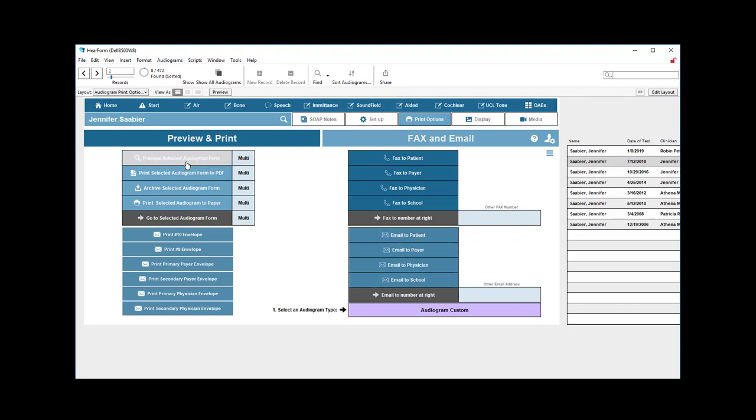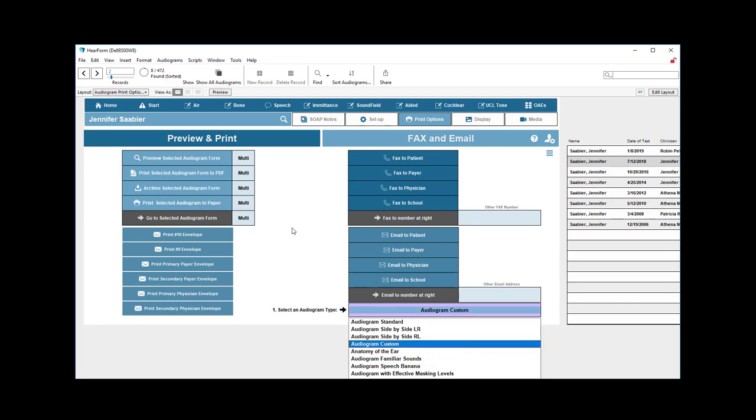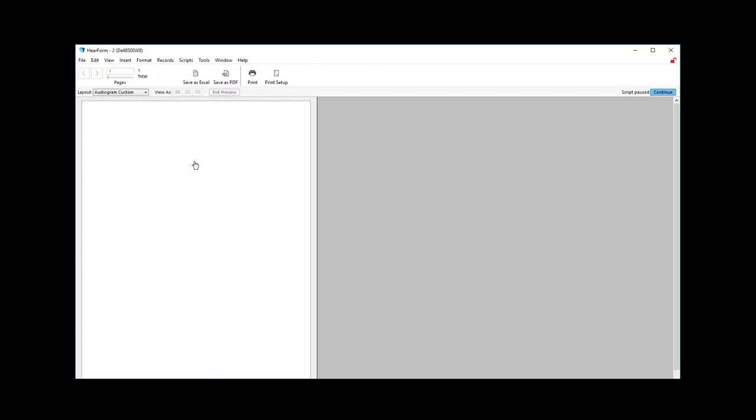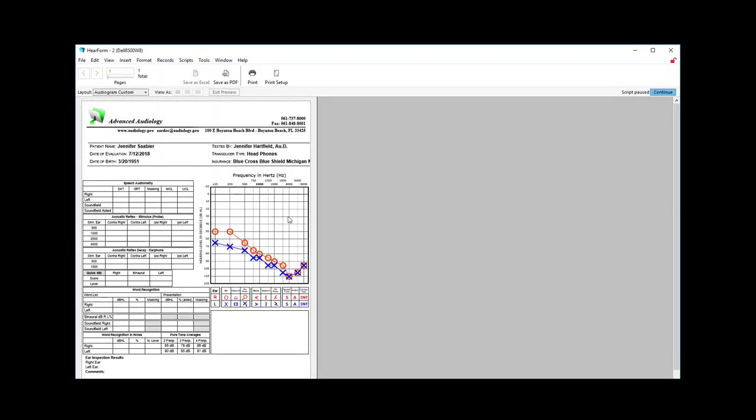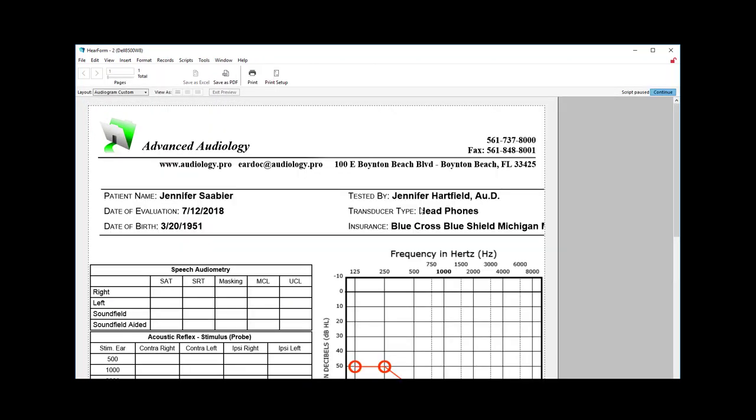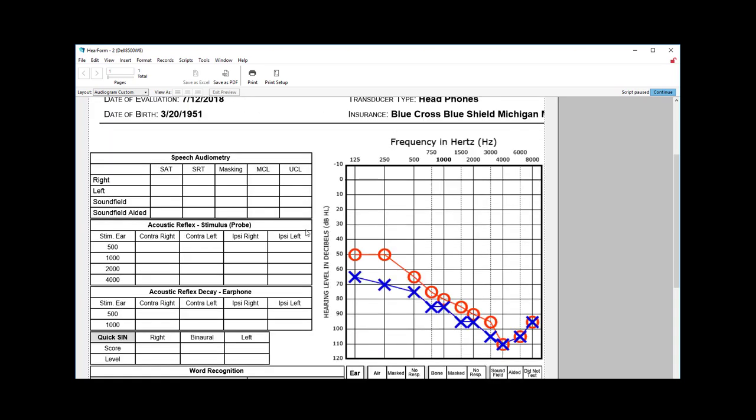Over here, let's take a look at some of these other options: previewing, printing, archiving, and printing something else. So I can preview the selected audiogram right here by clicking this button, and I'll zoom in just so you can see a little bit better. It puts the letterhead of the assigned office right at the top, the patient name, the date of the evaluation, the patient's date of birth, who tested them, what type of transducers were used, and the insurance company. As you can see, it cuts off a little bit there because that's a very long insurance company name. We only have so much information, and we can slide that over if desired, but then we want to be careful of a long patient name.